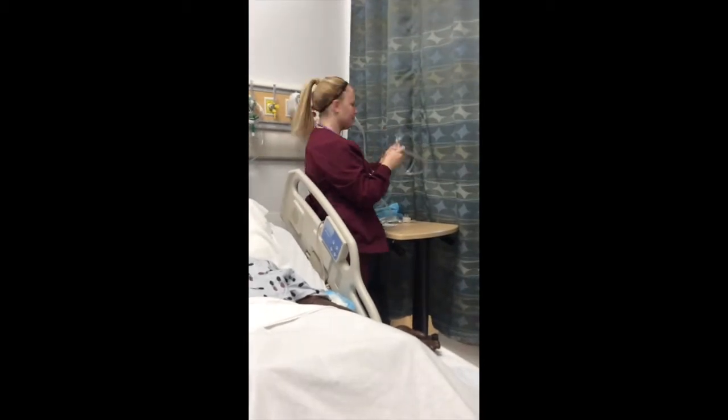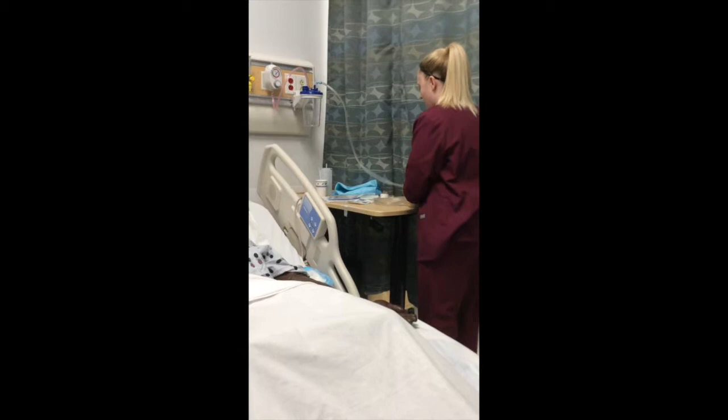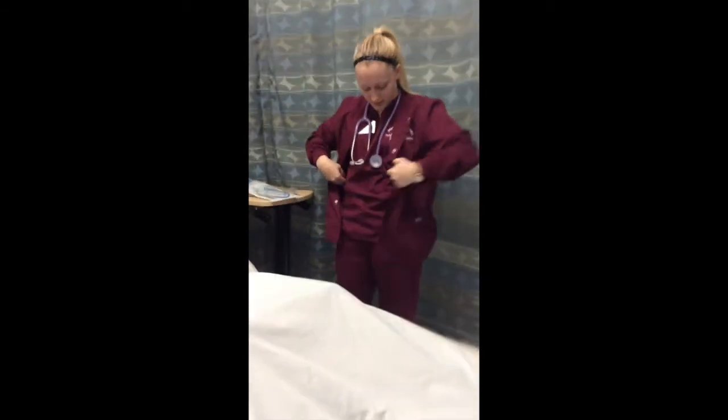Okay, and everything's good. I'm going to go ahead and turn it off. Set that aside. And then I'm going to go ahead and get my supplies ready. I'm going to go ahead and perform hand hygiene and put some gloves on.